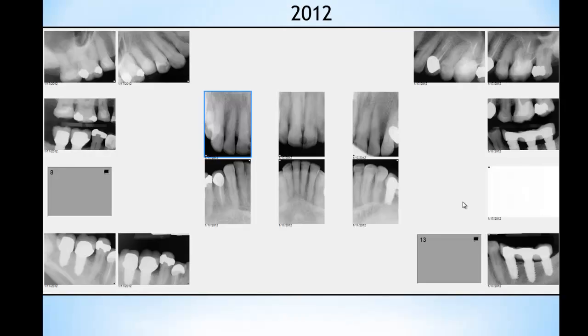And the other picture is from 2012. You can see that the implant has been placed and the restorative stage has been done. Some root canals have been redone, and some are new root canals. Restorative stage at the front. But again, I gave him credit because he understood the treatments, he understood the risk factors he is involved in, and slowly he can see his transformation while he's doing all this dental work.